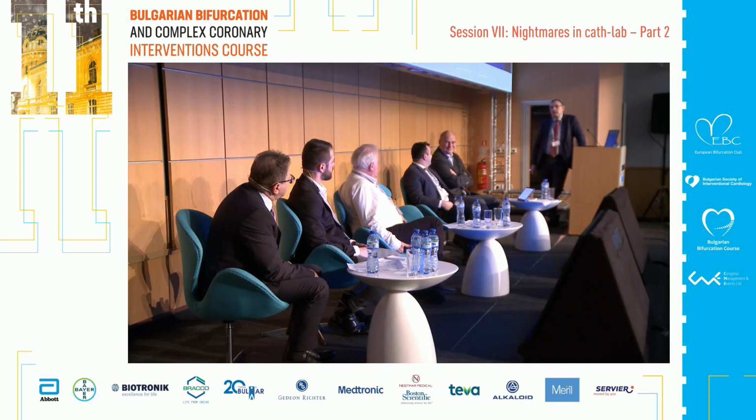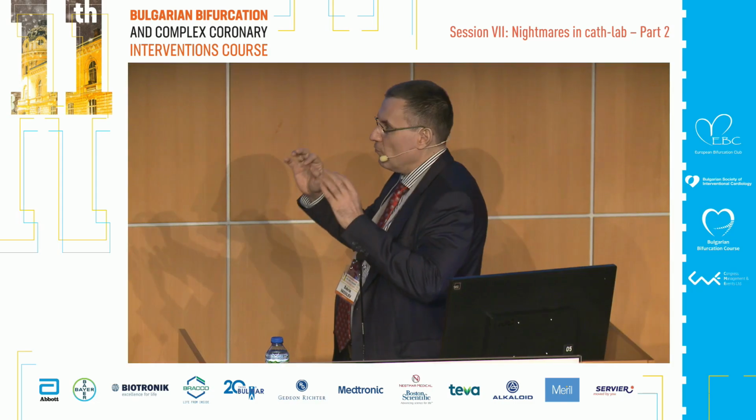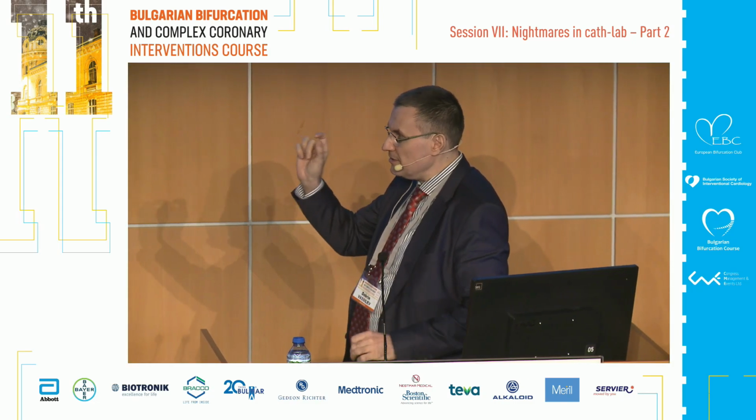Me too. Do you have a laser? No. But as I said, it was extreme. First, the lesion is very long. Yeah. We succeeded in the first 1 centimeter.